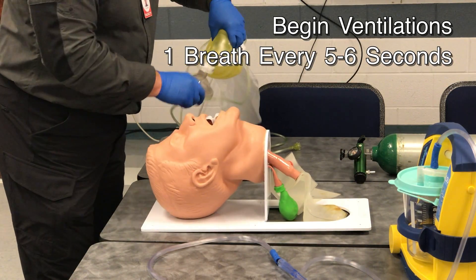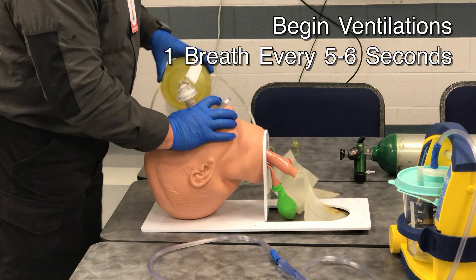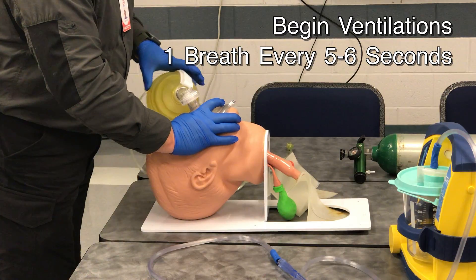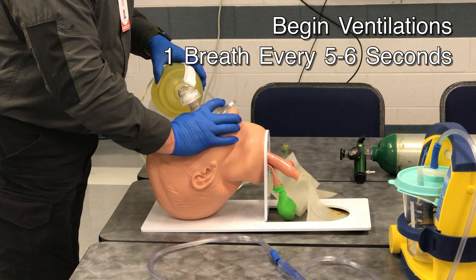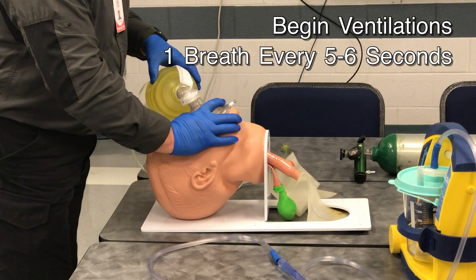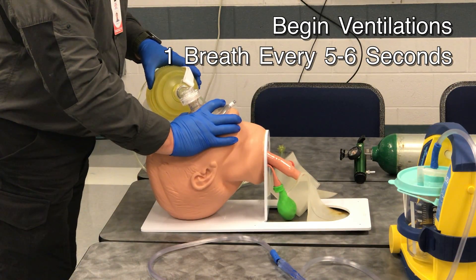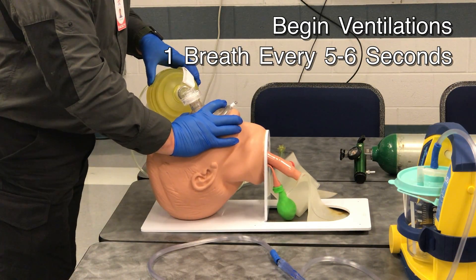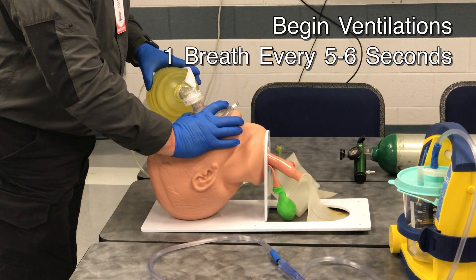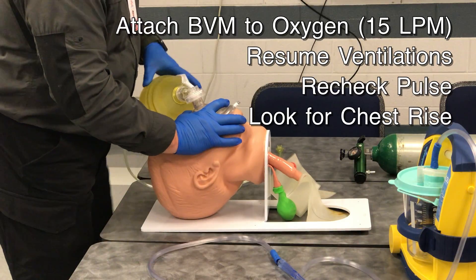Using an EC technique, I will then begin to ventilate my patient looking for chest rise. One breath — 1, 1,000, 2, 1,000, 3, 1,000, 4, 1,000, 5, 1,000. Noting good chest rise.